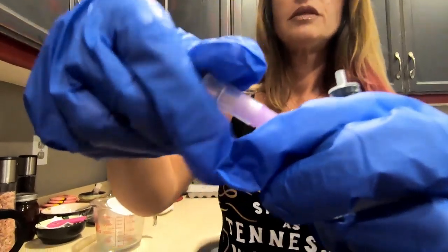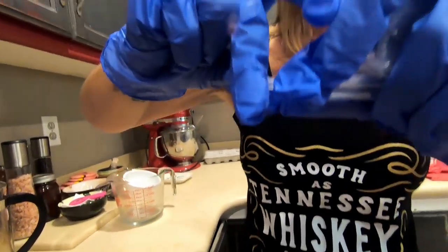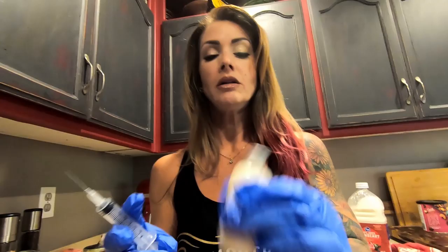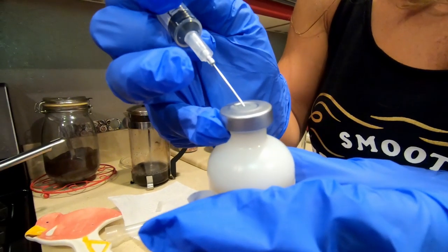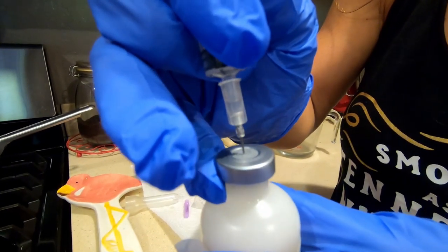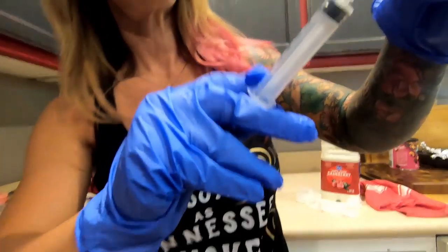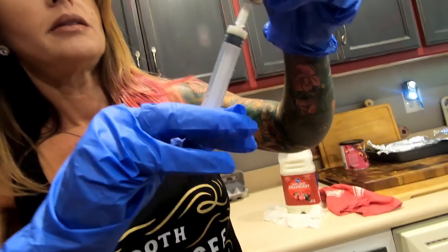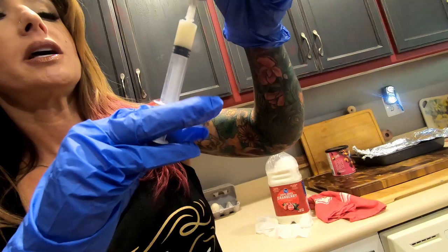I'm going to show a close-up of taking it out. You want to shake it up first and mix it well. Then you want to take the needle into the center portion of the vial, going in at a little bit of an angle so that you don't take the rubber stopper with it. Once you get that in there, flip it up and make sure all the air is out. Pull to 2 mLs — pull it a little bit over so that you can get some of the excess air out.